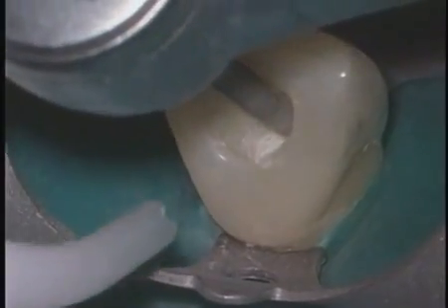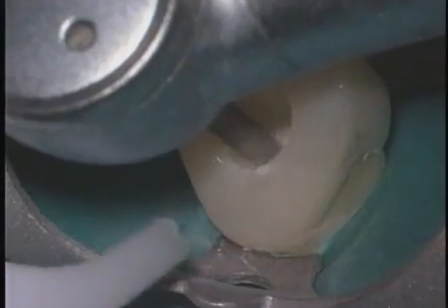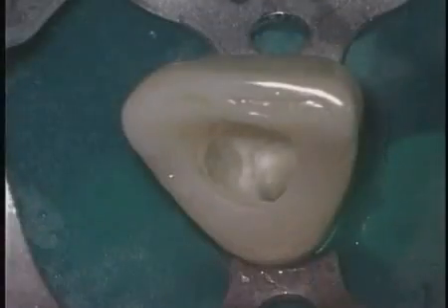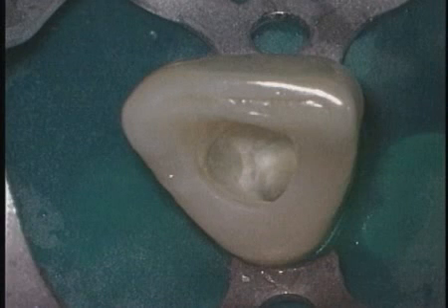The bonding agent is a very thin translucent material, and then this is a preparation for your final restoration, which should be a dual cured material. The restorative is finished, and you can see how we manage this coronal 1/3 perforation.